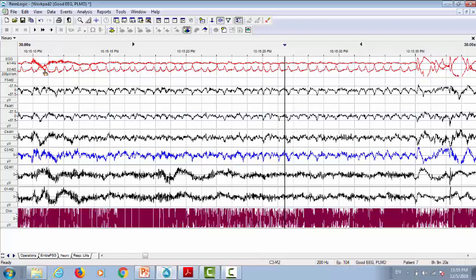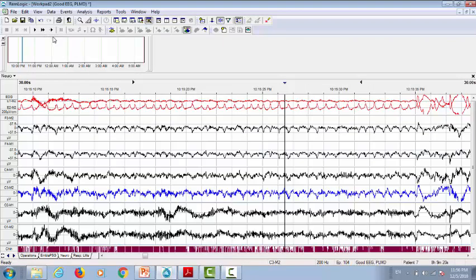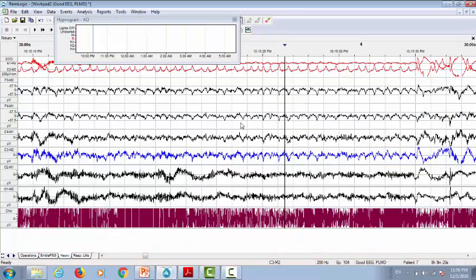According to what we see here over the EEG traces, we have very obvious blinks, and according to the AASM guidelines, when we have blinks, then we score active wakefulness. To view the hypnogram of that patient, from the menu bar we go to View and select to display hypnogram. We will use the hotkeys assigned for scoring sleep stages: 0 for wakefulness, 1 for N1, 2 for N2, 3 for N3, and 5 to score REM. We will press 0 to score wakefulness.